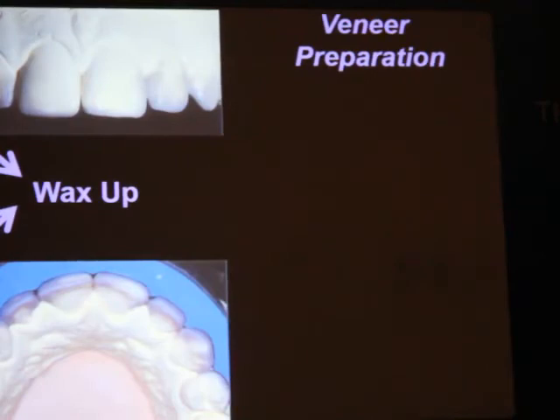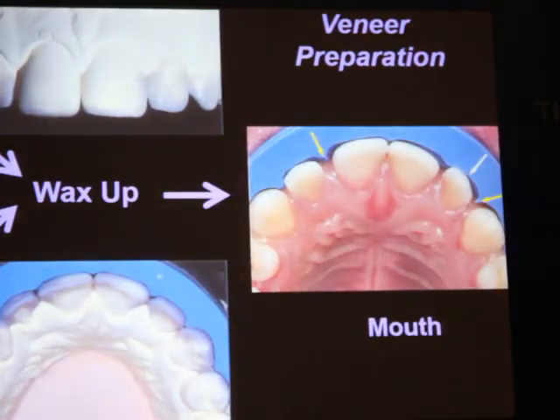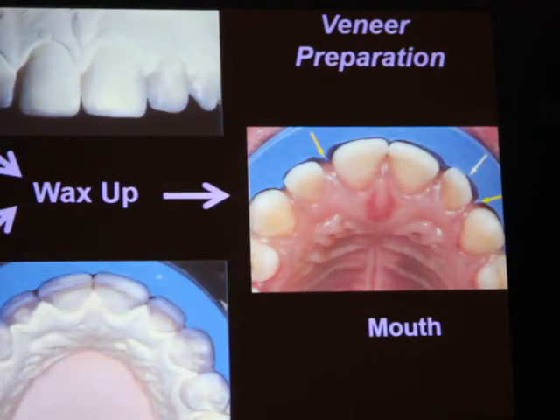And after, when your patient comes to prepare the veneer, you will use this key in the mouth, and you see immediately, oh, here, we don't need to prepare my tooth because I have distance. Here, as the opposite, we need to prepare more.